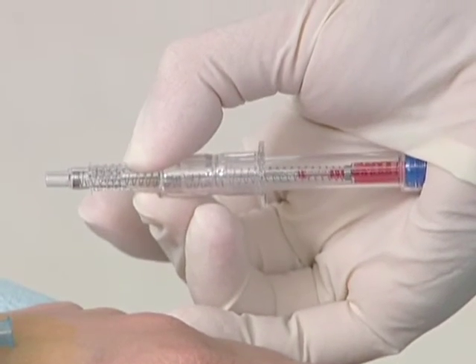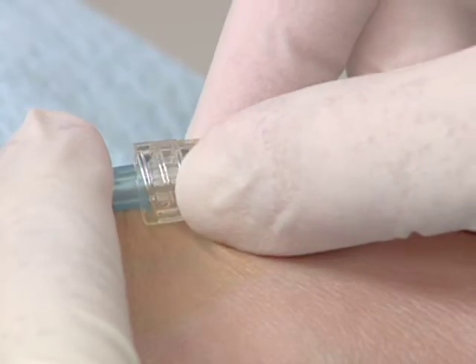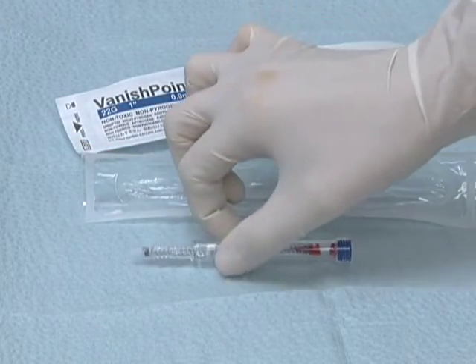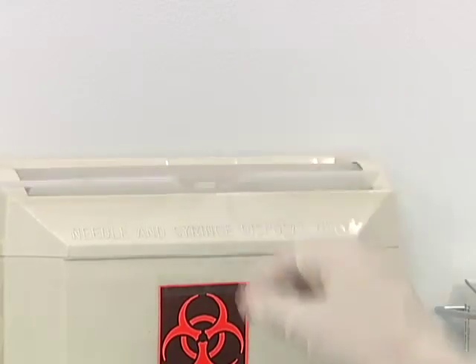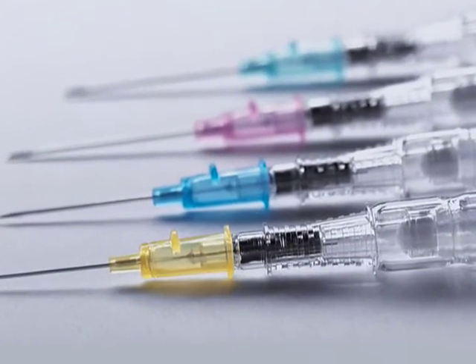Now, let's take a step-by-step look at using the Vanishpoint IV catheter. Select and prepare the insertion site with an appropriate antimicrobial agent according to your facility's policy and procedure. Remove the needle cover and inspect the catheter unit. The bevel-up orientation of the introducer needle, as indicated by the push-off tab, allows clear visualization of the flashback chamber.